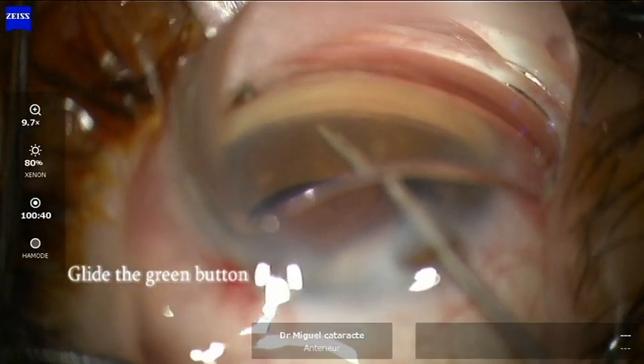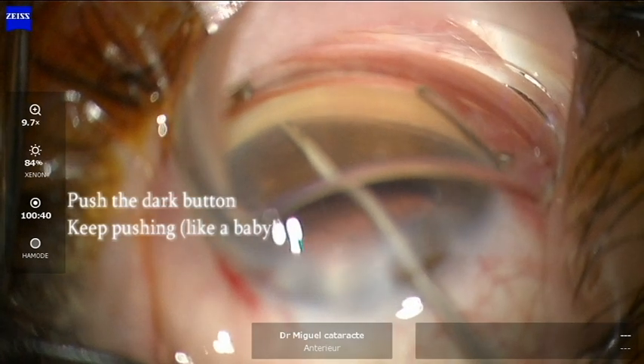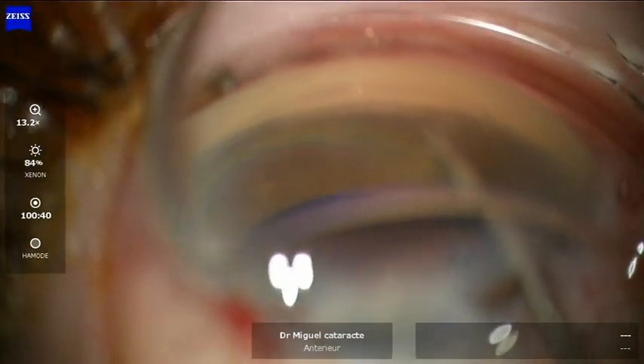Now delicately gliding the green button to expose the trocar, then pushing against the trabeculum and pushing the dark button while injecting, and afterwards while we retreat softly.